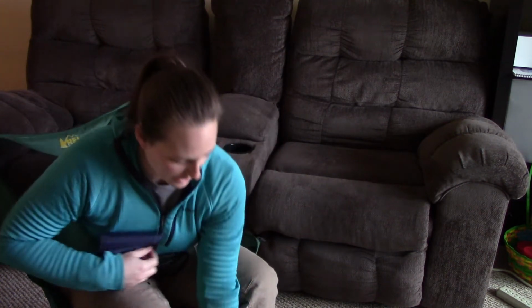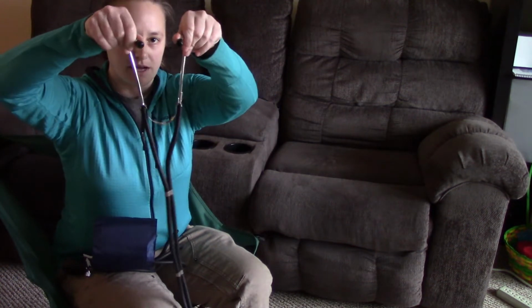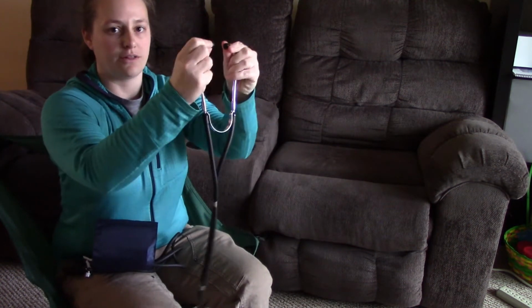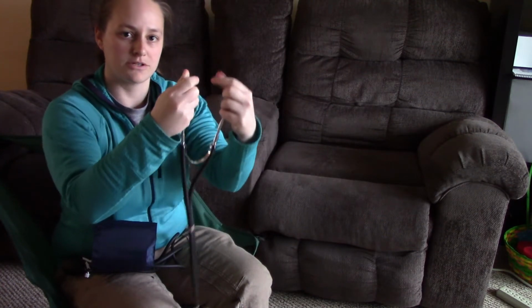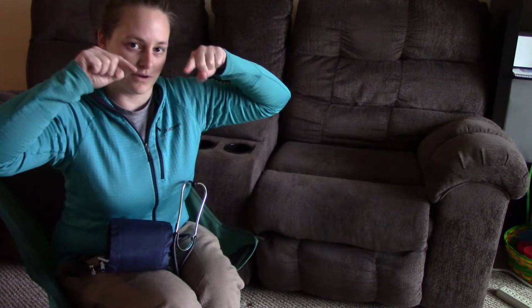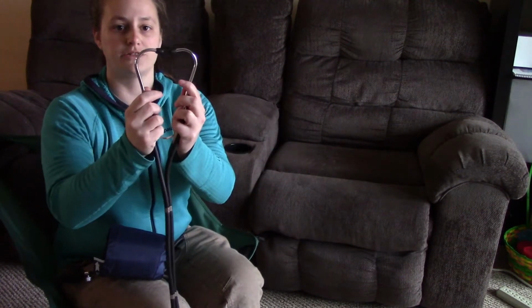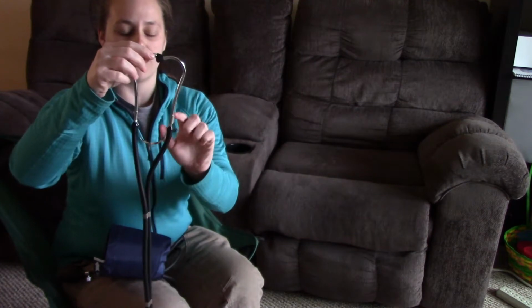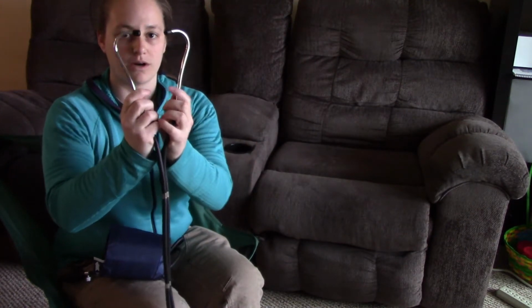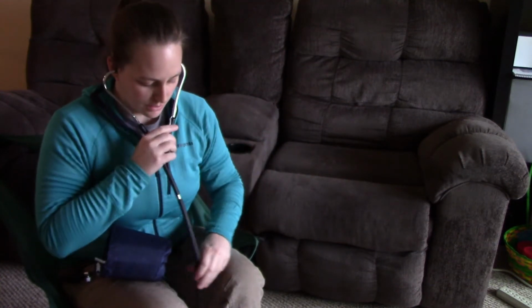The other thing you want to check is your stethoscope. The earpieces do rotate. They can either face each other directly, or they can push forward, or they can push backwards. One thing to keep in mind is that our ears, the holes actually go towards the front of our face. So if you have a brand new stethoscope and the earpieces are pointed directly at each other, they rotate here, and we want to push them maybe 30 degrees forward so that when I put these in my ears, they're going to be facing forward.